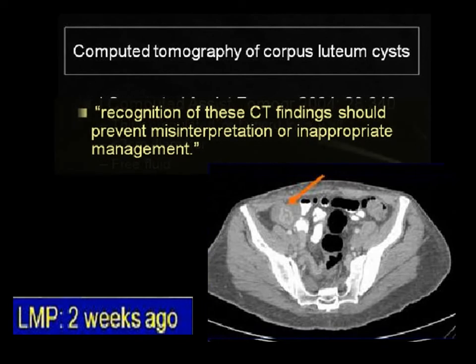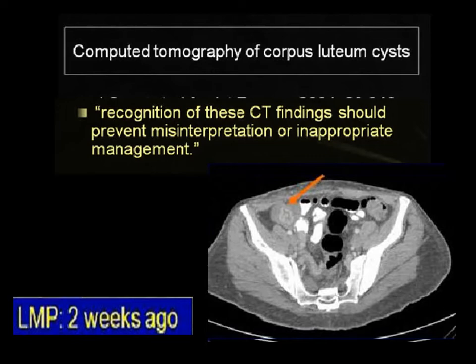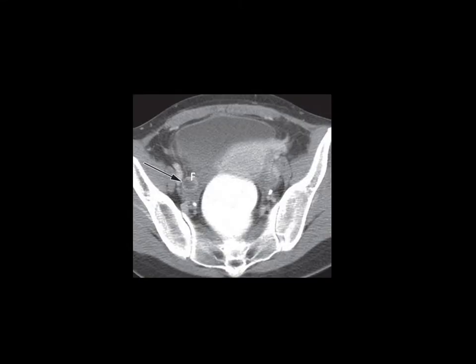Recognition of corpus luteum cysts on CT prevents misinterpretation or inappropriate management. Someone might call this an abscess because of the thick enhancing wall and small free pelvic fluid, but you should remember corpus luteum cysts have this appearance and do not need any intervention — they resolve by themselves. On CT you can see a thick enhancing wall within the ovary confirming corpus luteum cyst.